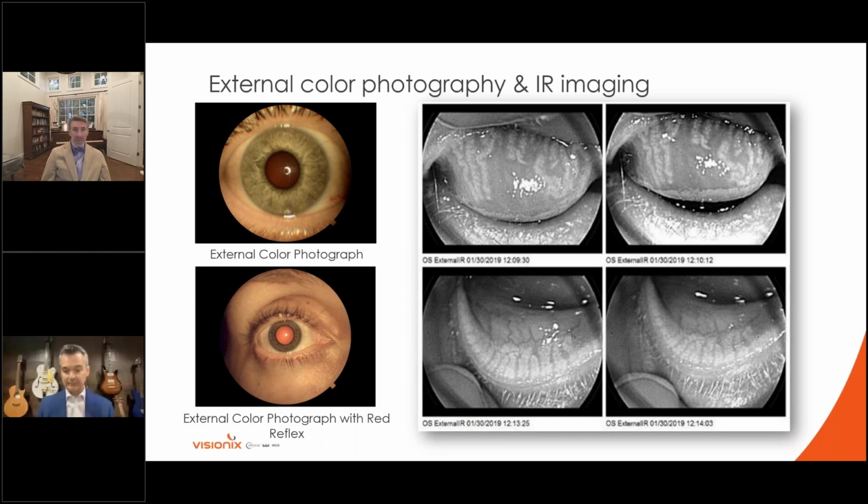I mean, you basically cannot be prescribing scleral lenses unless you are also running a dry eye center in your practice. The two go hand in hand. The number one problem we see with scleral lens patients is dryness. And the second I see the front surface of the lens, you can actually see between blinks, the front surface just kind of evaporates away. Immediately when I see that, I'll take a video of that in the slit lamp, and then we'll run over to the OCT. We'll do meibography and get an idea of what the lay of the land is for the meibomian glands.